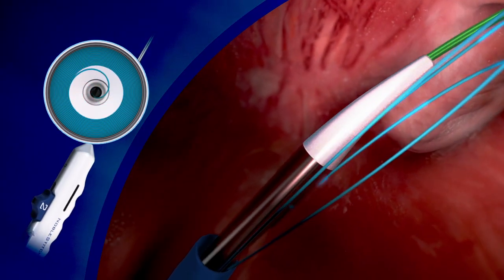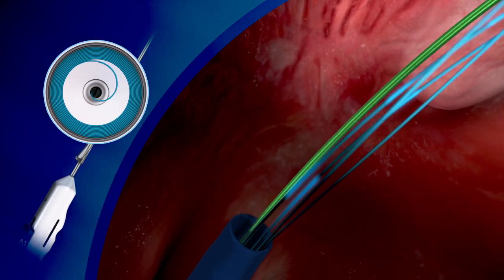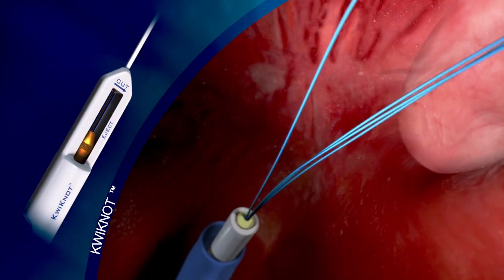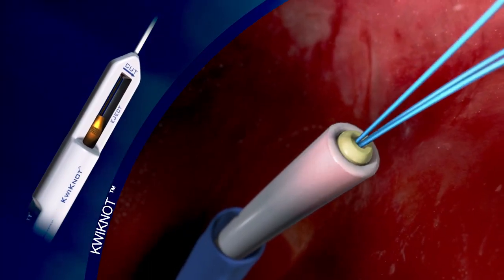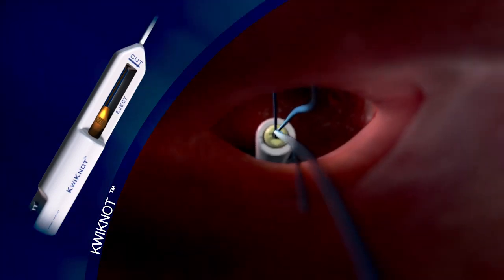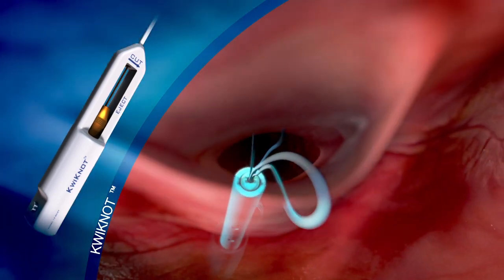The device is withdrawn, visualizing the suture funnel, demonstrating that the suture has been captured. Then the 032 wire is removed as well. The quick knot is then advanced over the polypropylene sutures up to the oval fossa through the introducer sheath, which remains in the right atrium.